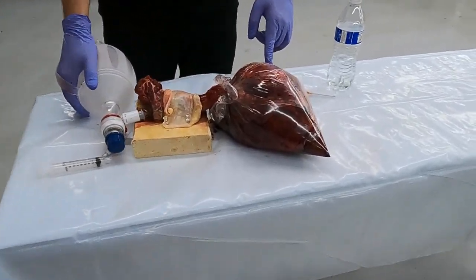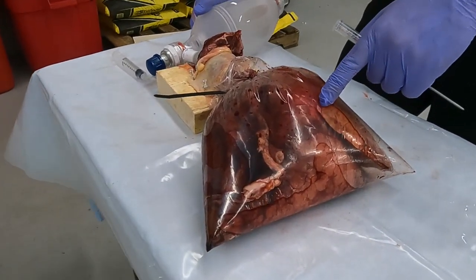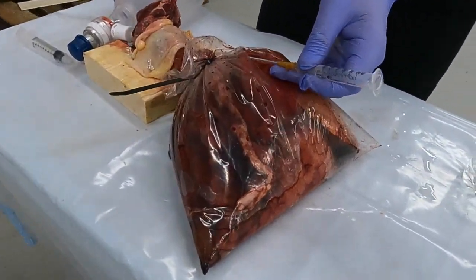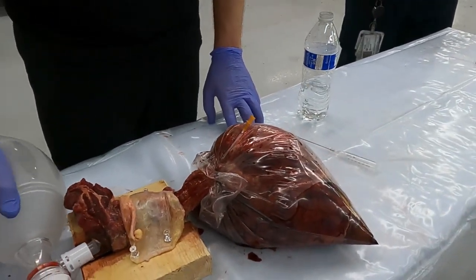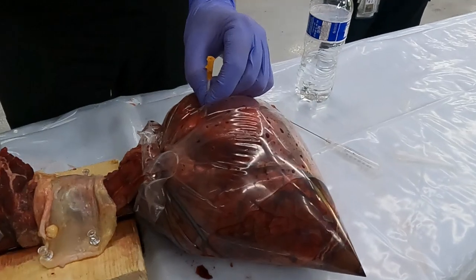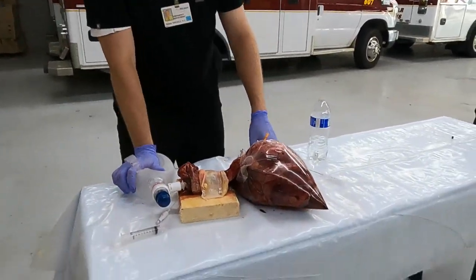These pigs have been dead for some time so we're going to over-ventilate to get the lungs to inflate. You'll notice these lungs have intentional holes in them. We can also look at that potential space between the chest wall and the lungs that's preventing full inflation. We can introduce needle decompression between the second and third rib space in the mid-clavicular line — advance the catheter in, and in real life that potential space will prevent you from hitting the lung. That should allow the lungs to fill more, and you should get an air leak. On a live patient they'll typically take a big breath and say they can breathe again — it's not a permanent solution but it's doing much better.